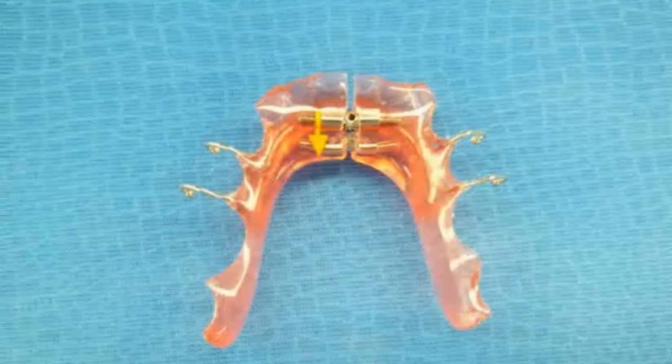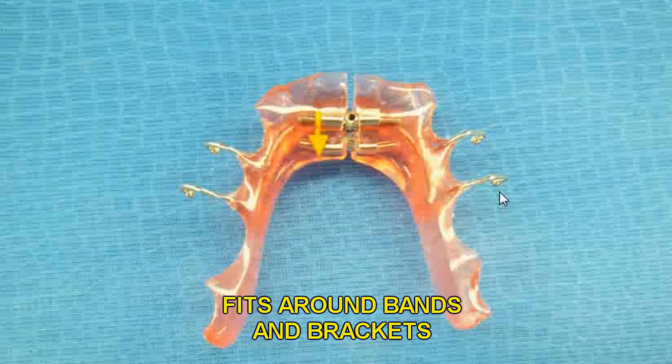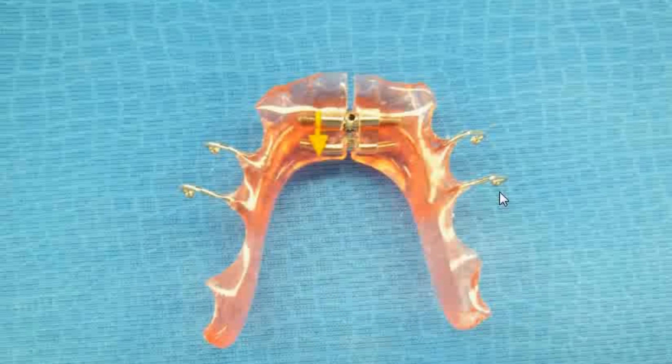The pop-in appliance is made with ball clasps to fit around the bands and brackets. There is no labial bow to interfere with the brackets. The appliance is very simple and allows you to gain the space you need pretty quickly. You can leave the arch wire in place while the patient is wearing the appliance or remove the wire altogether. It's up to you.